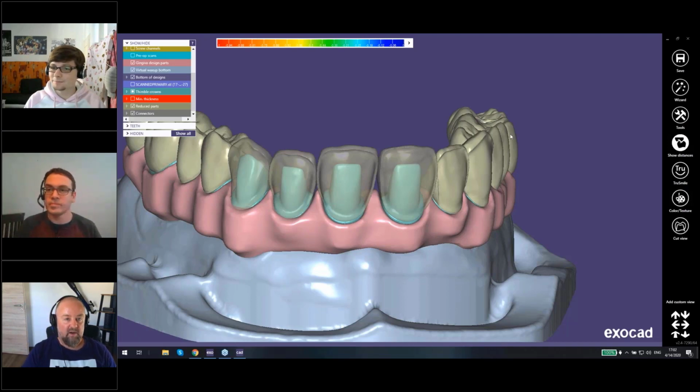Okay, I think time is running out. Friedemann, thank you for the demonstration, and all you guys, thank you for being here. We still have a couple of questions, and Lucas will try to answer those questions when we get the report from the webinar. It might take some time, maybe tomorrow or in 2 days, you will get an email with the answer to the questions.